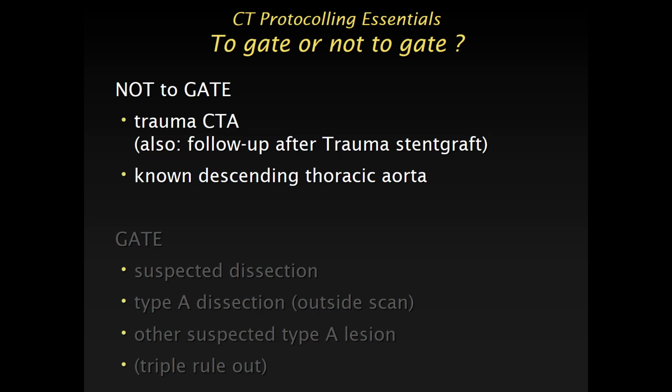So you don't want to use gating for everybody who has a trauma CT angio. Particularly, most of these patients are also young. Right? So people like tonight will be a good day, it's nice weather. Young people hanging out, driving fast, drinking too much, and then they end up like this, right? So that I think is quite straightforward.